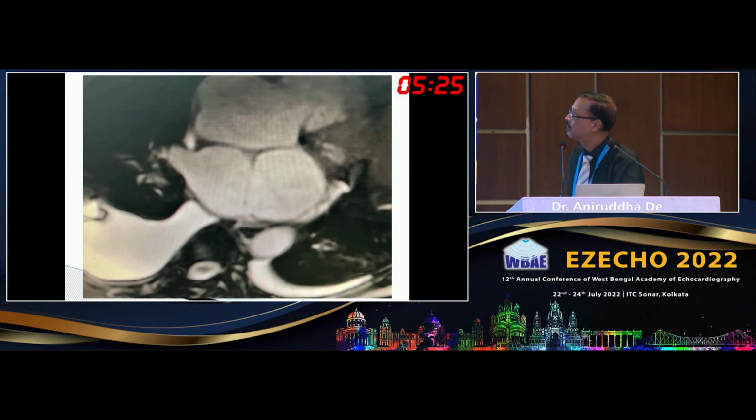But before that, let us look at the MR. I think one mechanism is atriogenic too, because his atrium is quite dilated because of the MR. So the annulus is remodeled, which is causing the non-coaptation. LV is not that dilated, but LA is. So I'm calling it atriogenic MR. He's in sinus rhythm. There is no problem, and there is no doubt in the diagnosis.